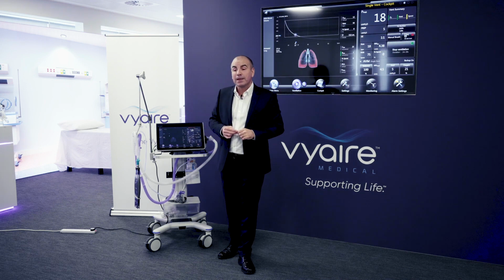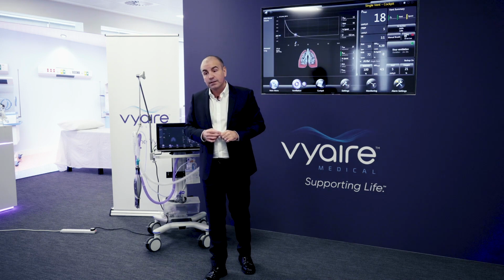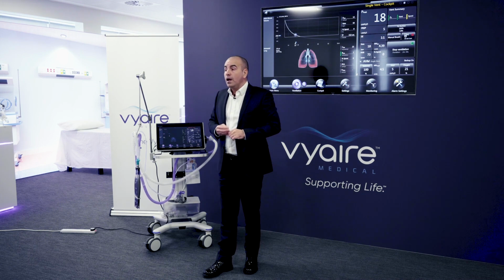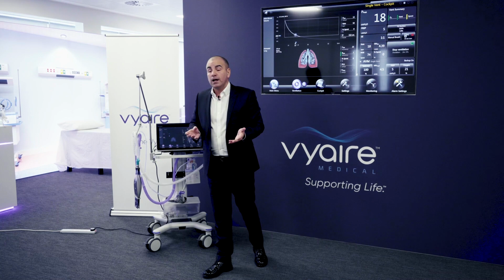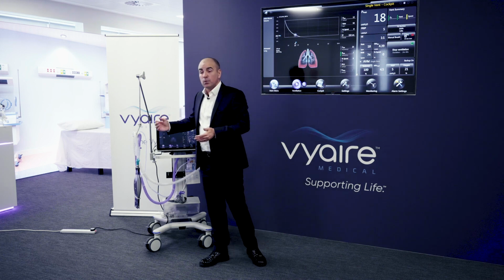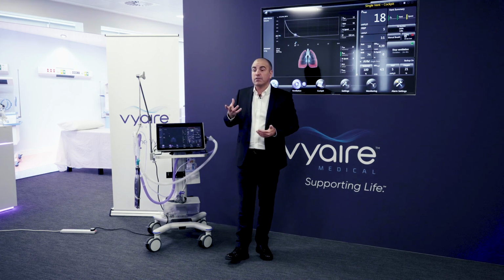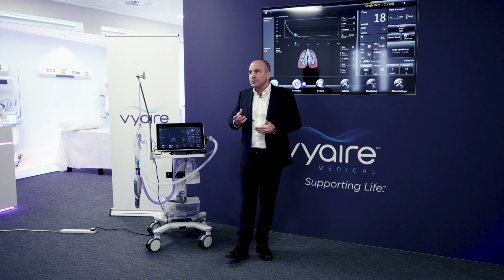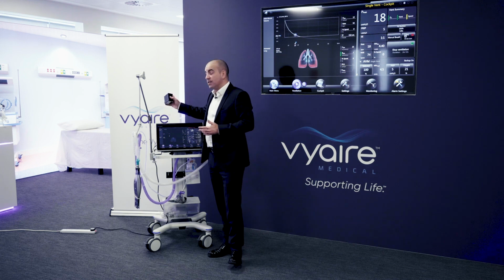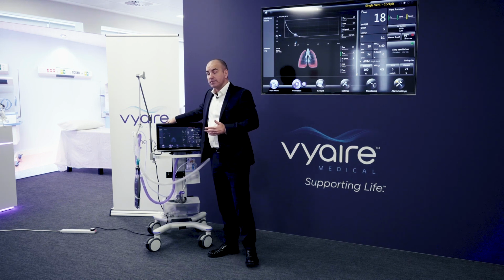Hello. You said that you can have the HEPA filter as an option. Yes. Why would you not want that if you're using the ambient air? The hospital's infection control policy will dictate which direction they go. We have a standard filter, which just takes regular particles out of the air, but in light of the times that we live in, it's a very handy feature to have. And you would just change the internal filter every 30 days.